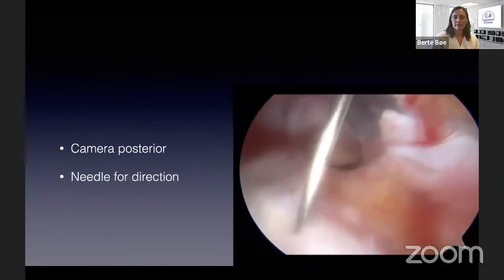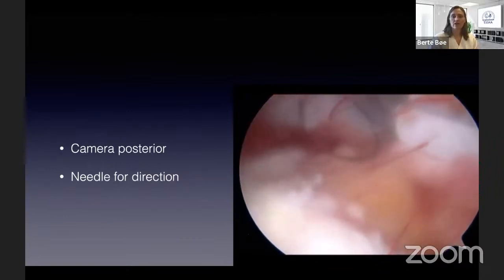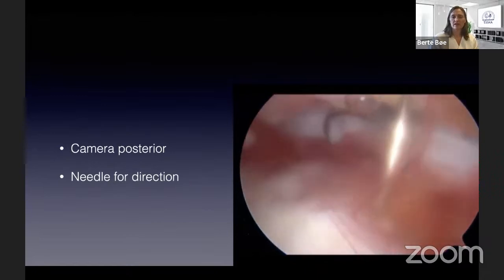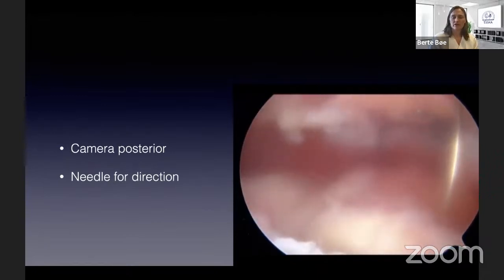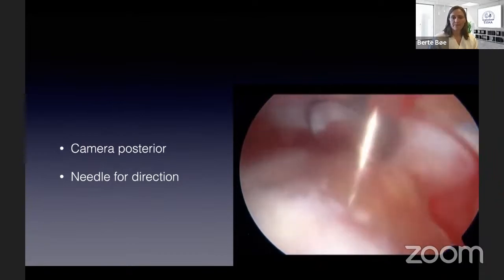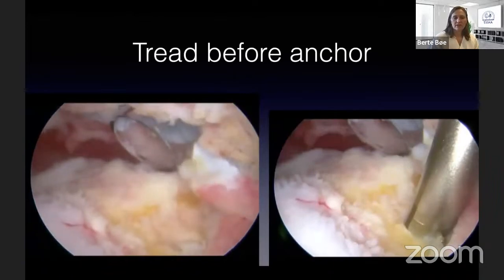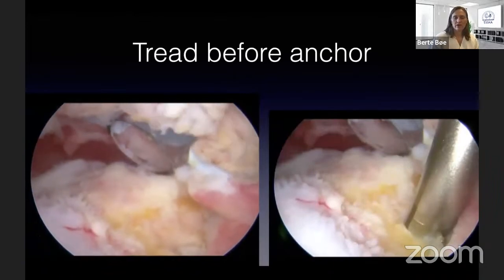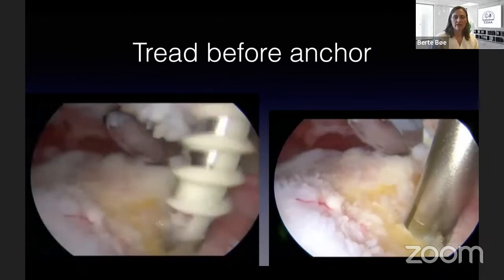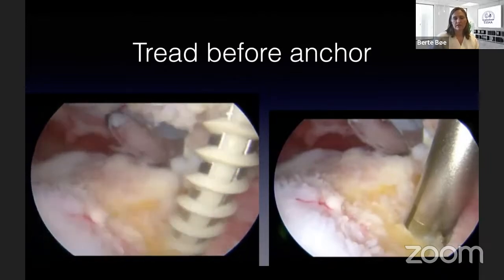So now the camera is posterior again, and I need another portal to place my anchors. So often I go with a needle first just to see where the anchor will come. Try to stay pretty close to the acromion. And I use anchors that have to be threaded before you screw in the anchor. And then you also get an impression of the bone quality.